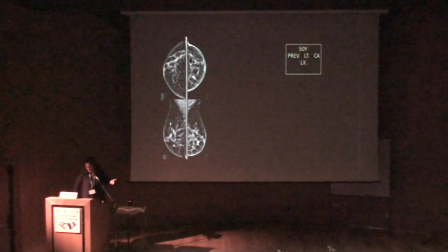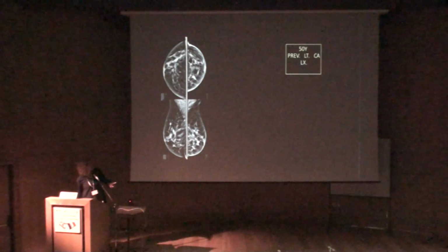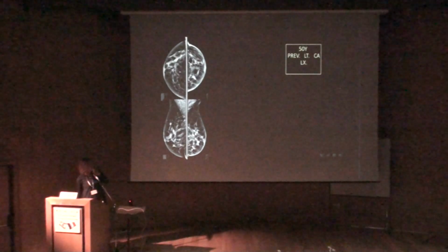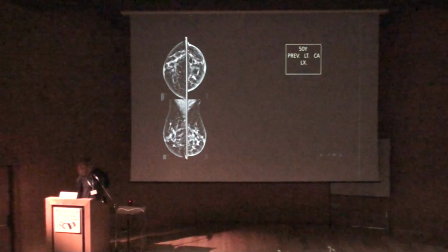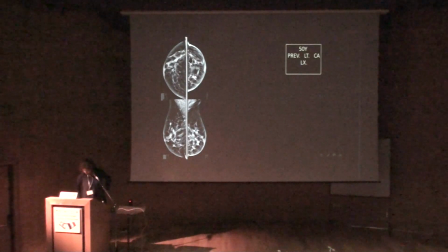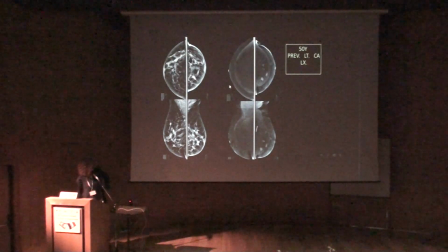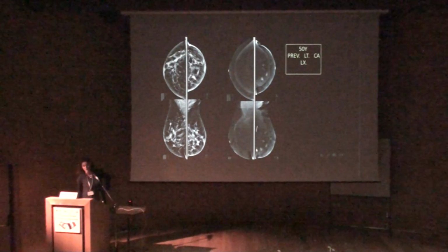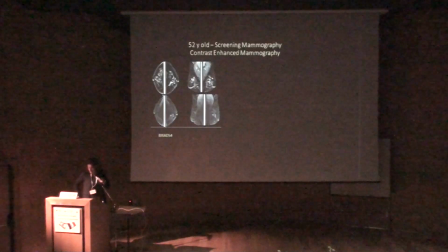And this is just another case, again, a woman that already had breast cancer, she had a surgery, here we can see the scar, and she came with a palpable lesion in her left breast. Maybe there is a density here, but those are the contrast high energy images, and we can see that she has many lesions which were proved to be cancer. So those are the images.